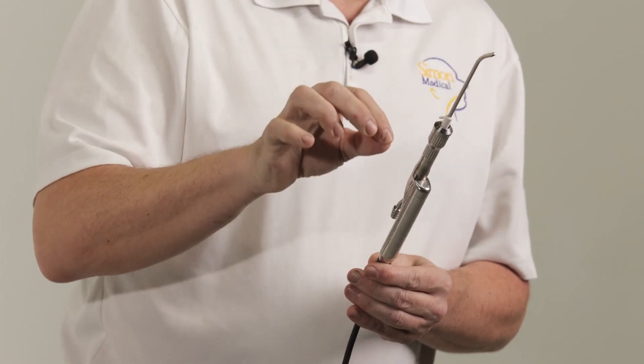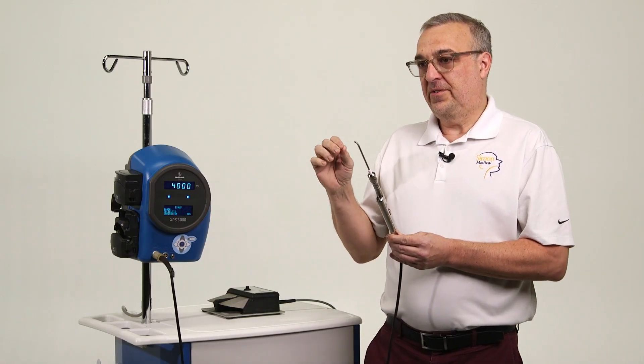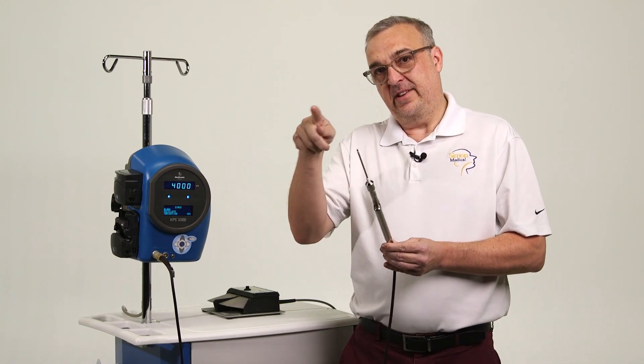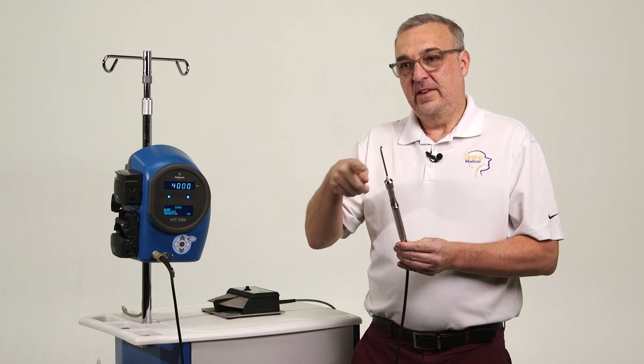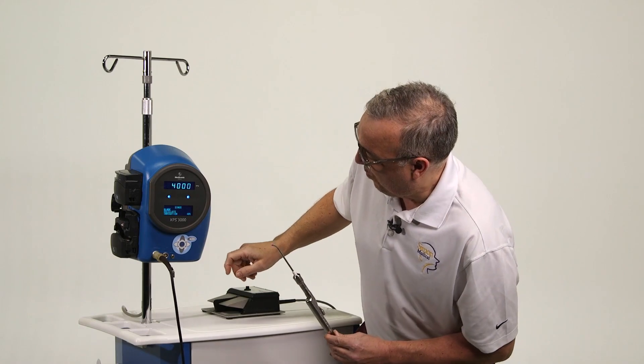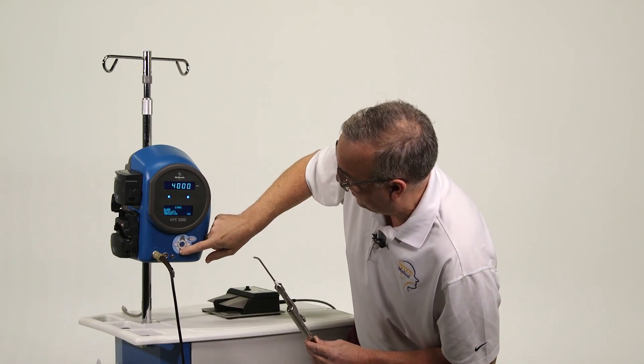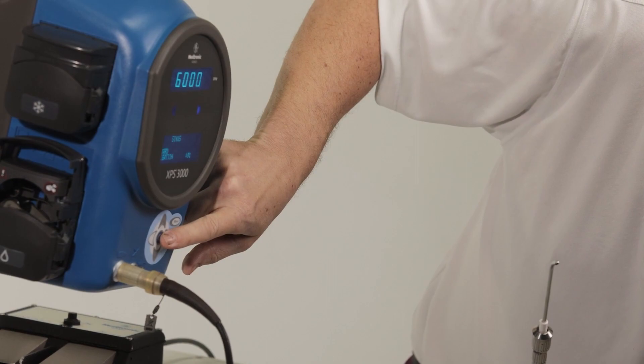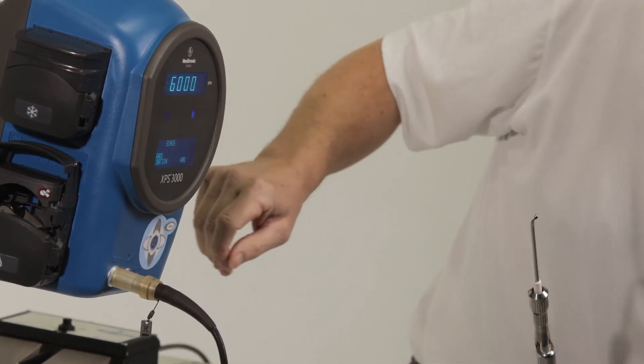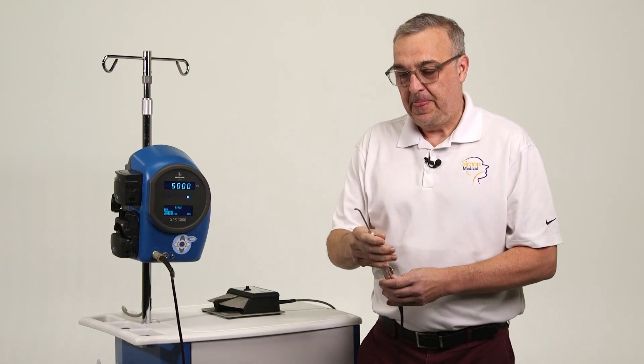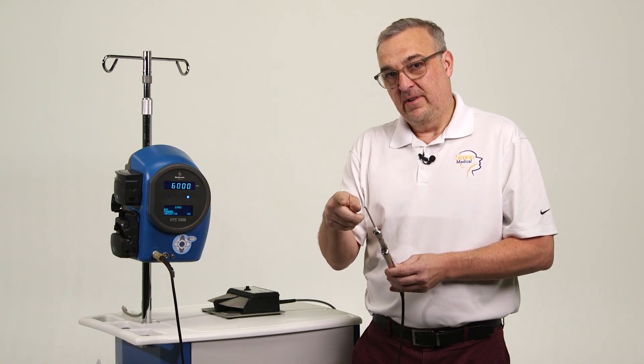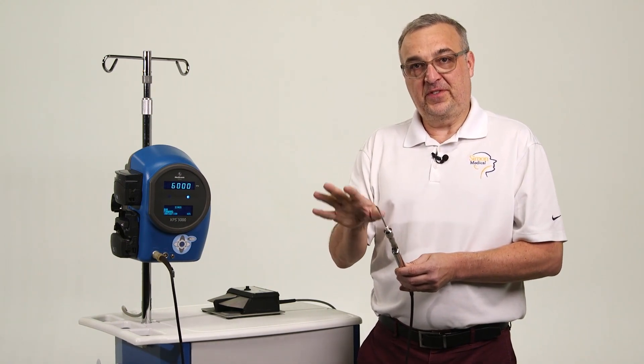There are certain scenarios like a laryngeal blade or certain sinus cases that are very delicate where you may want that blade to rotate, just clockwise, just in a rotation versus an oscillation. If we want to do that, we press the middle button and now we're on forward setting. So if I press this, now that blade is rotating 360 degrees in one direction. Not done all the time, but just so you know, it's there.